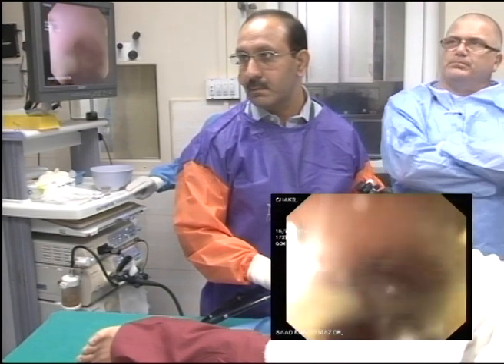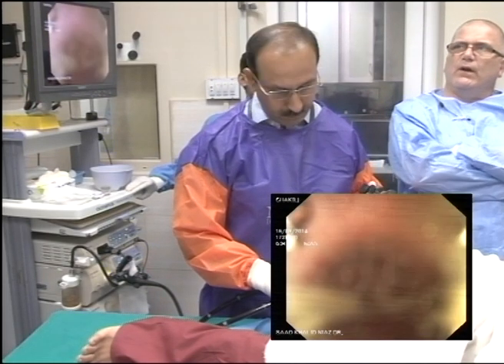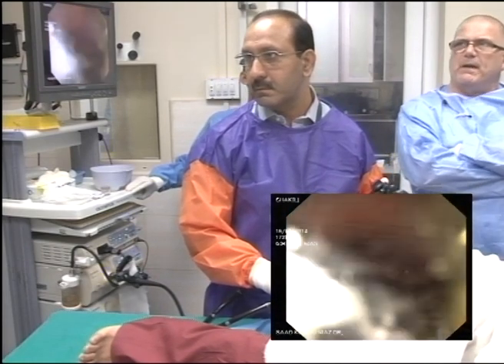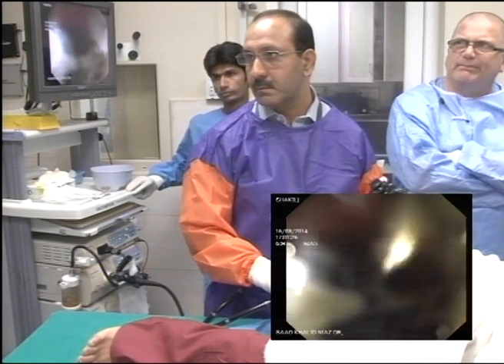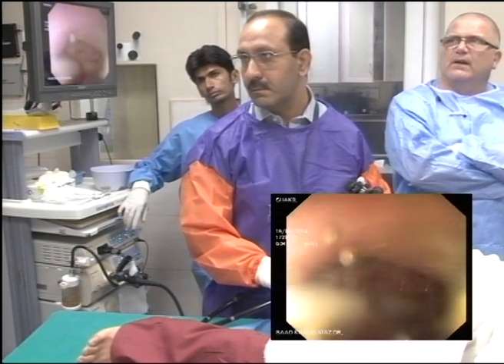I agree that quite often it's totally unnecessary. Well, I learned from you last time that if I see a polyp, I'll take it off here. But if that was back in the UK, I would have ignored that polyp. Yeah, it wasn't of any significance. I totally agree with you.